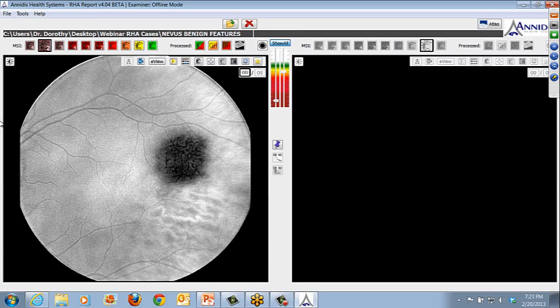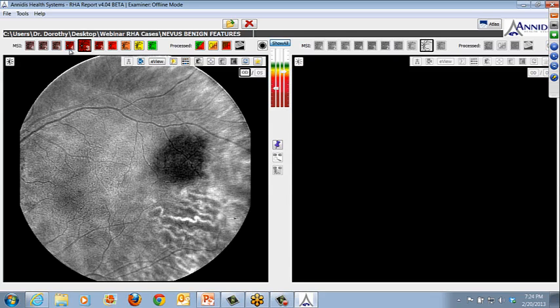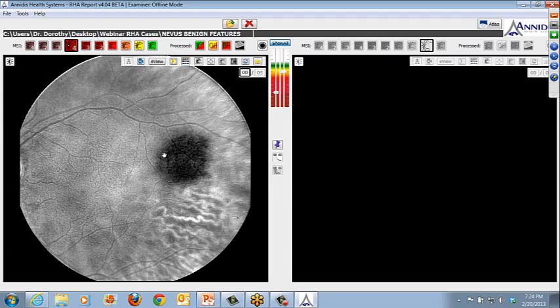And I know that it's not going to be the same at each level. Looking at a patient who has regular traditional fundus photography, we're only seeing what's projected through, and so we're not seeing that exact detail. At least with this, we can get that detail at those different levels. Right, and I actually agree with that. And you can see in much more detail at the different layers exactly where the edge is and if there are changes.